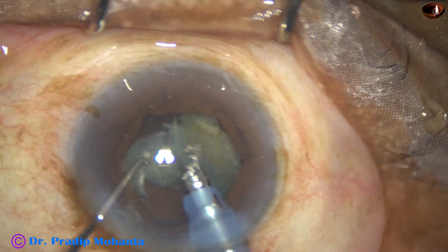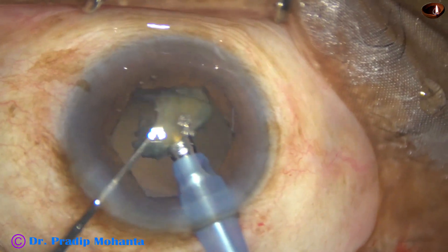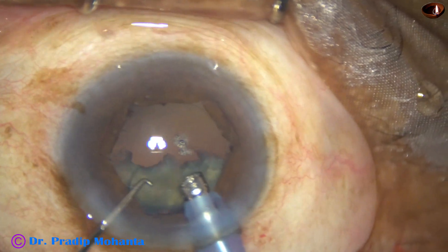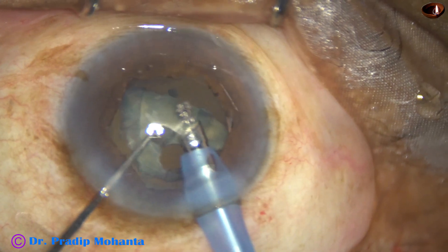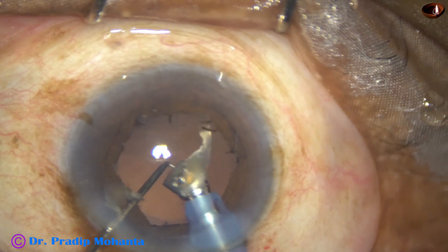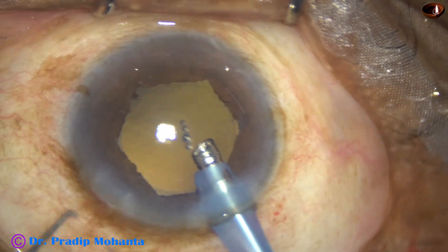This is the last nuclear piece. Here, I am going to catch the posterior capsule. I have caught the posterior capsule — there is some wrinkling of the posterior capsule. But just in time, I could release the foot pedal, and I examined and found that the posterior capsule is okay. Decrease the vacuum to 250, flow rate 25. Ultrasonic energy also reduced to 70 percent and very gently, very slowly emulsify the last piece.